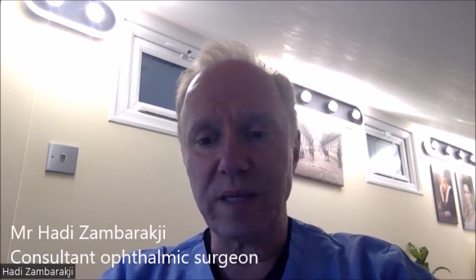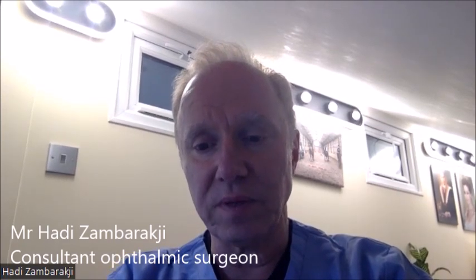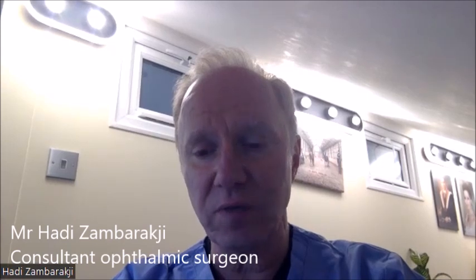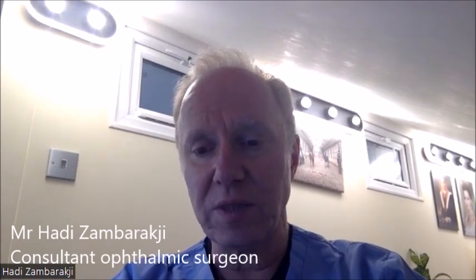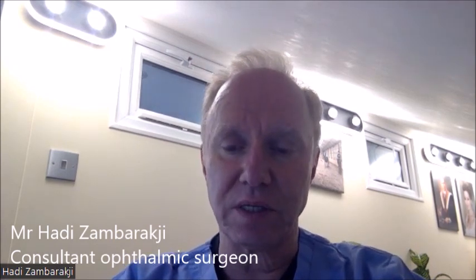To achieve spectacle independence, or often I would say to reduce the dependence on spectacles, one can either use a multifocal lens, which, as I mentioned earlier, is a lens that improves vision at multiple distances, i.e. distance, intermediate, and near.